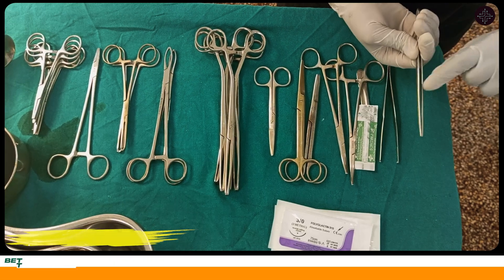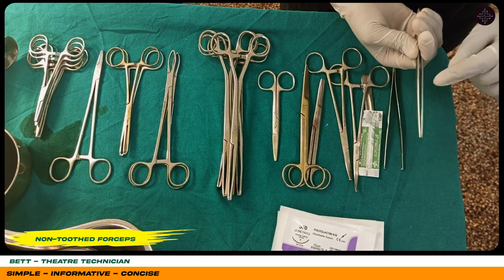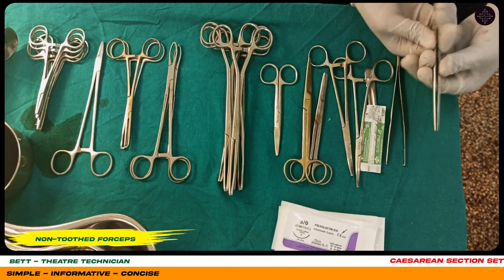This is a non-toothed dissecting forceps, mainly used for holding soft tissues.